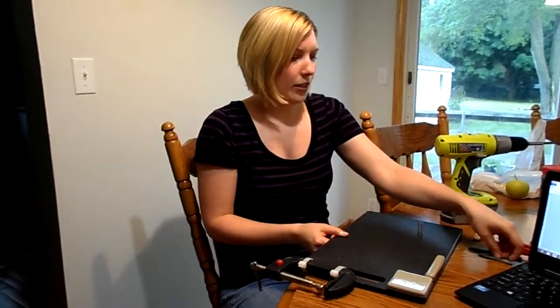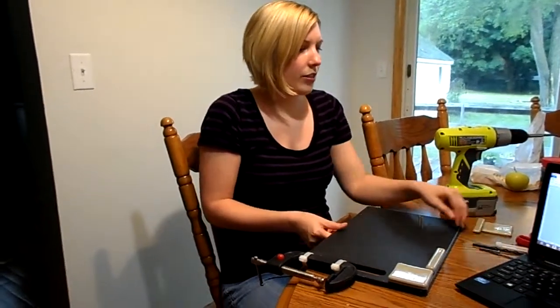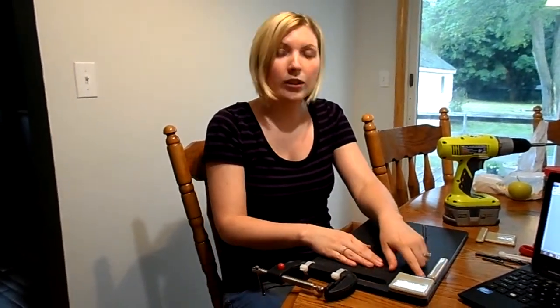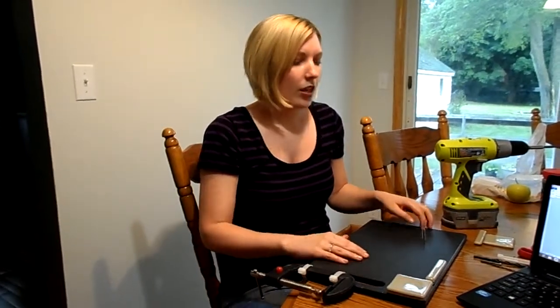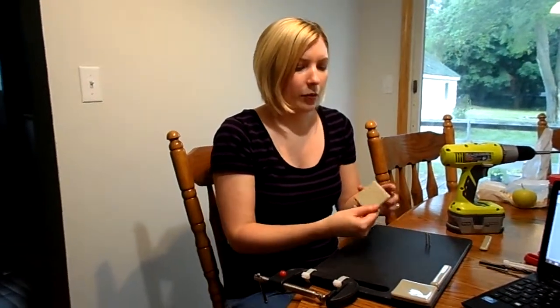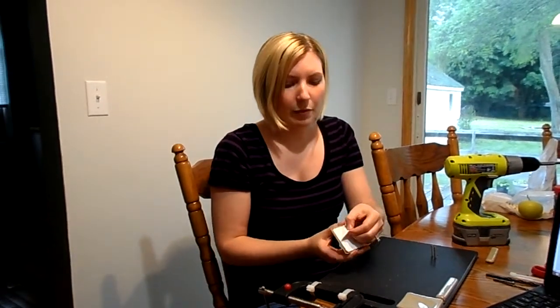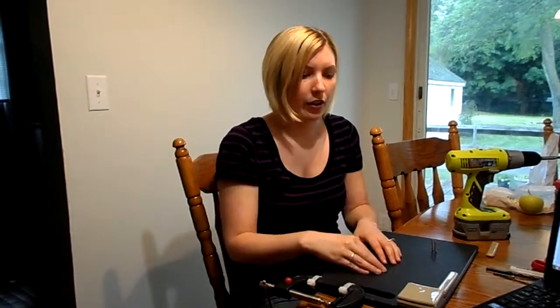The next thing you want to do is go ahead and create your bumper system for your food to hold it securely on the cutting board as well as provide some resistance. The first thing you're going to do is take one of your square furniture movers or furniture sliders, peel the adhesive backing off, and place it at the upper right hand corner of the cutting board.